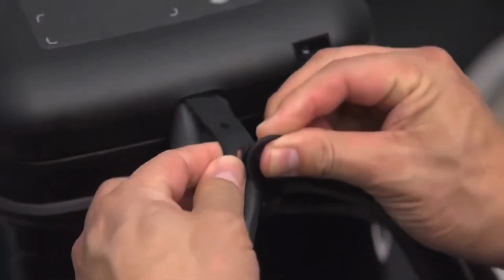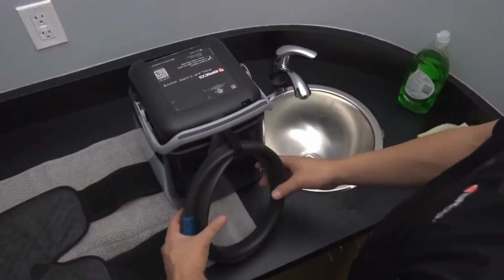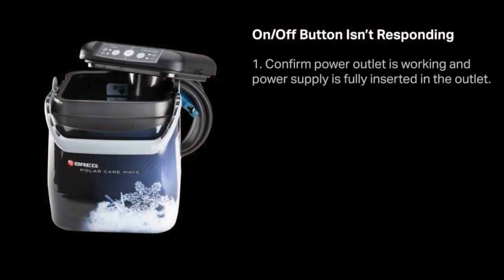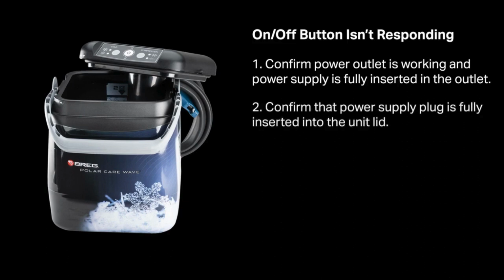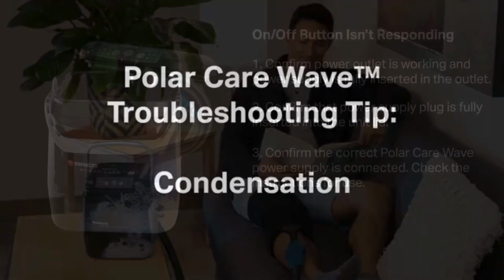If you are unable to resolve an issue using the steps within this video, don't hesitate to contact your local BREG sales representative. Wave troubleshooting tips. The on-off button isn't responding. Confirm that the power outlet is working and the power supply is fully inserted into the outlet. Confirm that the power supply plug is fully inserted into the lid. Confirm that the correct PolarCare Wave power supply is connected. Check the instructions for use.